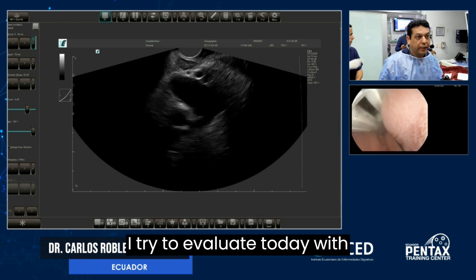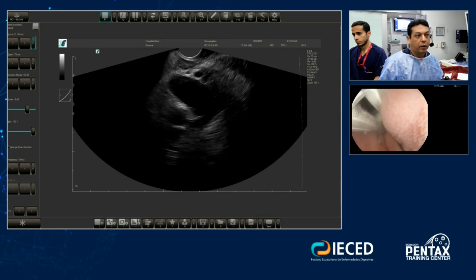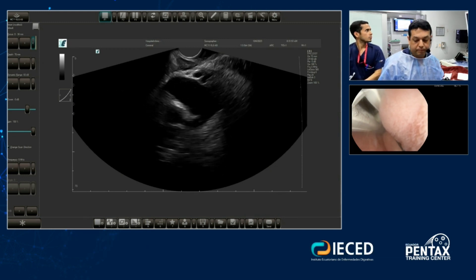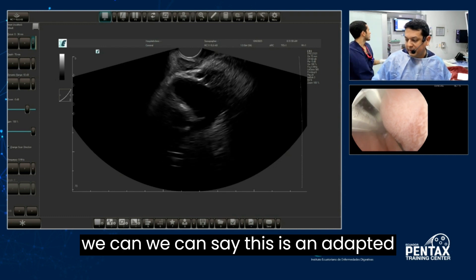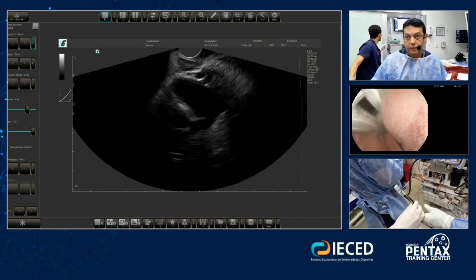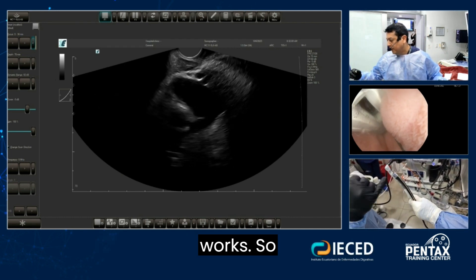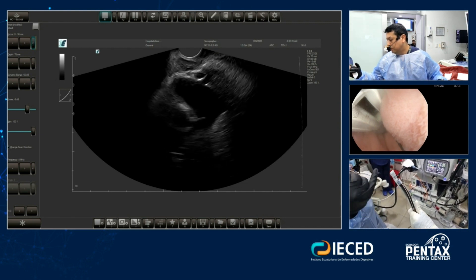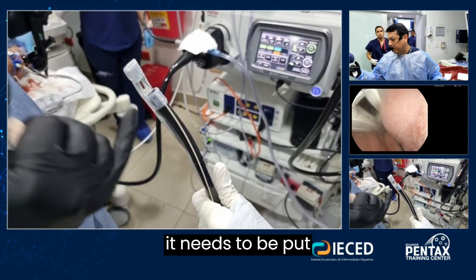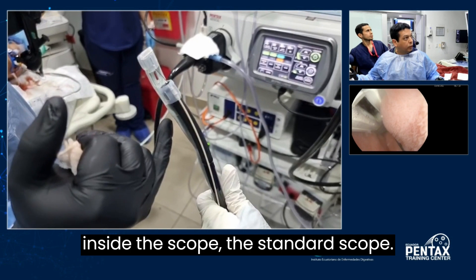I'm trying to evaluate today this new endoscopic ultrasound machine. This is an adapted ultrasound to a standard scope. Before I want to show you how it works — I don't know if you are looking for how it needs to be put inside the standard scope.